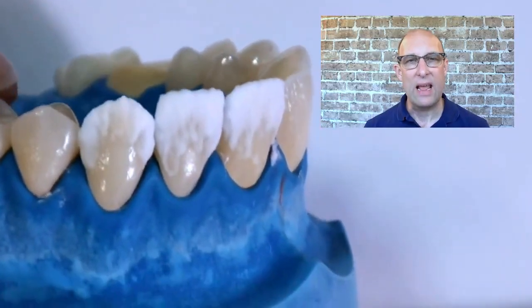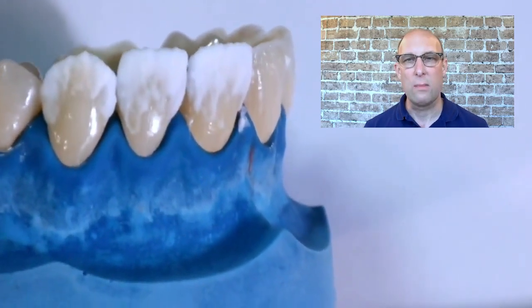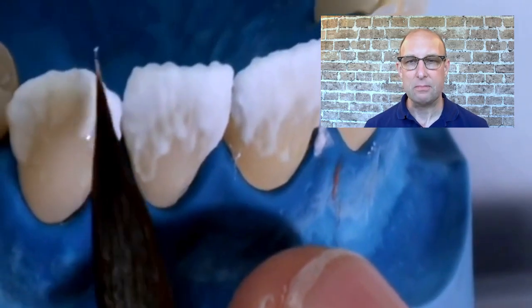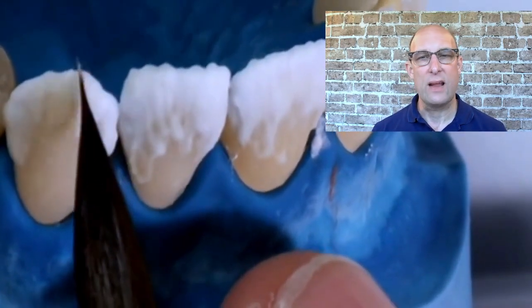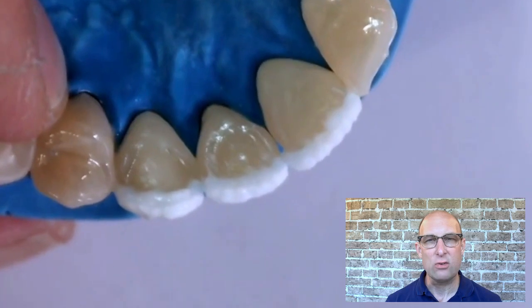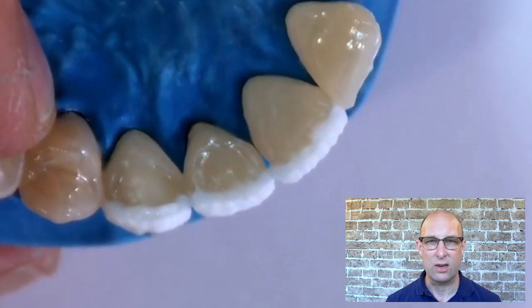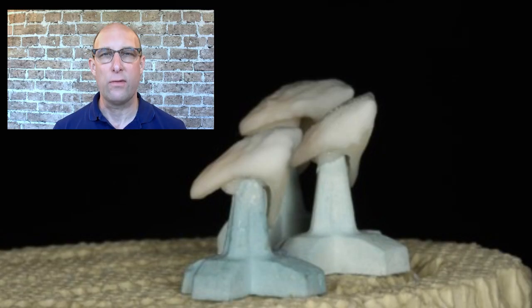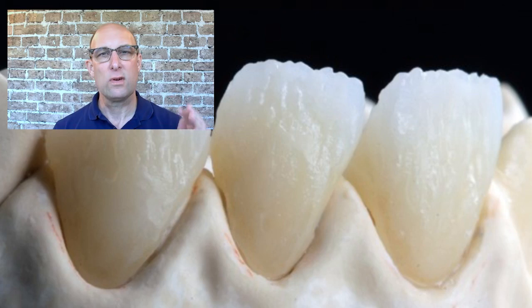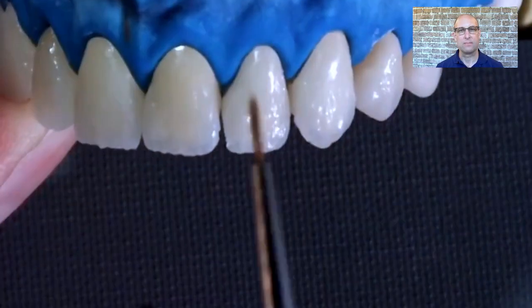I'm layering the lateral just like the central but with only two mamelons. On the canine, which has one mamelon, I use Mamelon Salmon in the center and also add a little Special Incisal Gray to enhance the internal translucency next to the lining. From an occlusal view I check that the original tooth shape is correct and that I didn't bulk it out too much facially. After finishing the layering, I place the units in the furnace for the first dentin bake. Important: place the units on a pack secured with pack putty in the most horizontal position possible to avoid the porcelain curling toward the incisal.